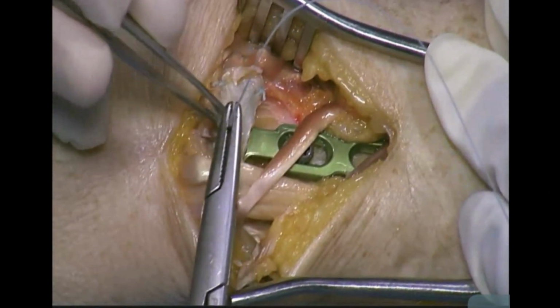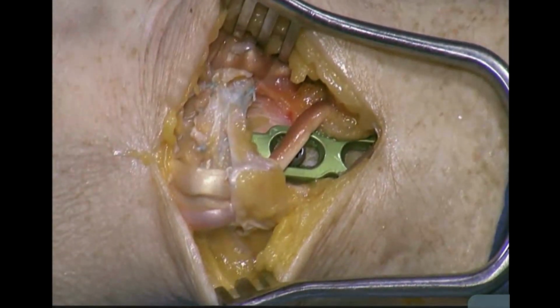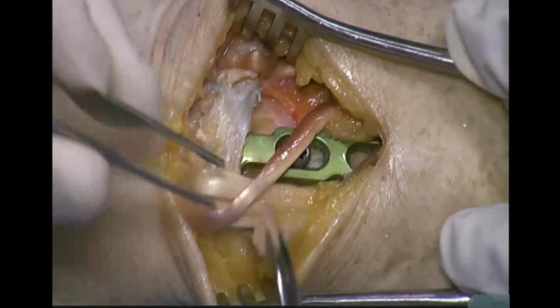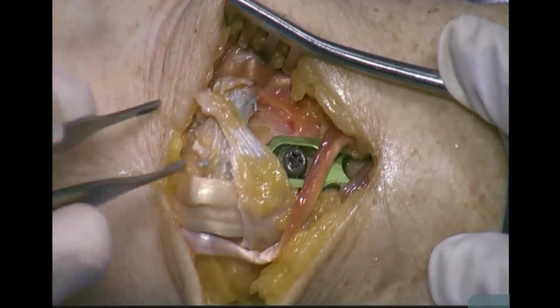I'll add one more centrally. So the remainder of the retinaculum, I'm going to pass over the tendons of the second and fourth. The EPL is going to stay superficial.